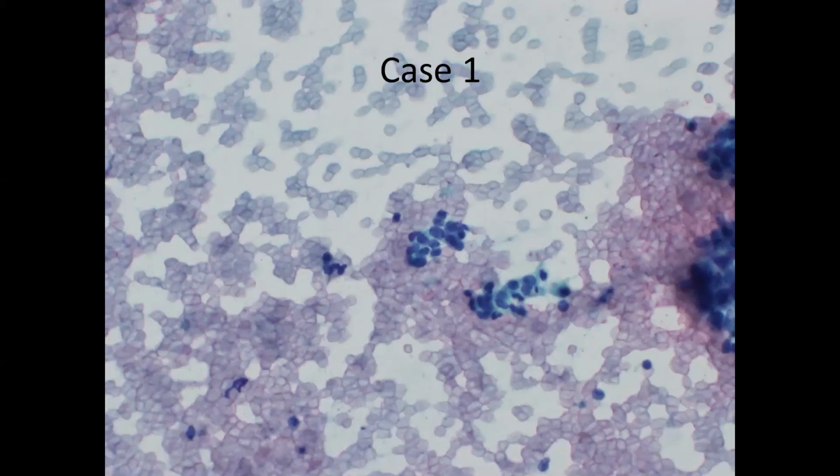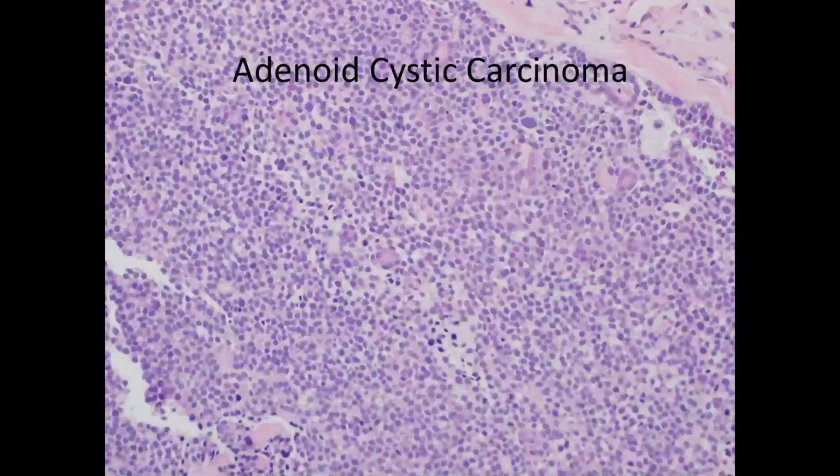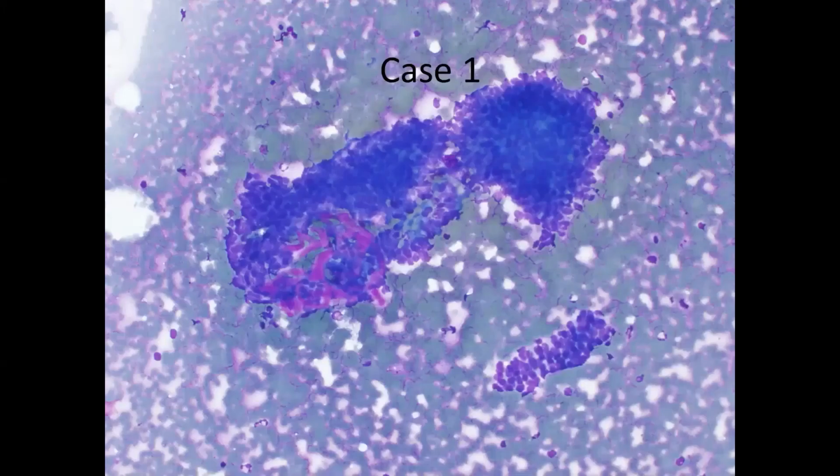Again, you can take note of the hyaline stroma for whatever it's worth. And at resection, this ended up being a solid adenoid cystic carcinoma. If you take a step back, the cells actually look very similar to the adenoid cystic we saw in the last section. It's really just that we don't have that very characteristic stromal material, except for just that bit that we saw here.